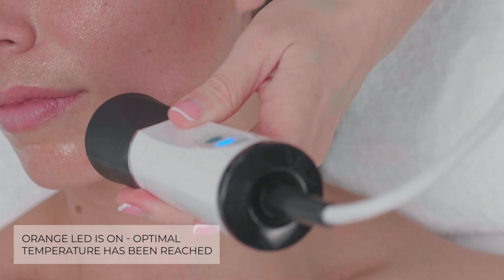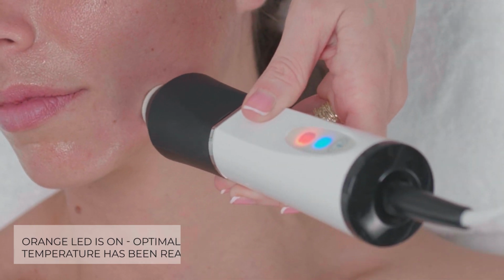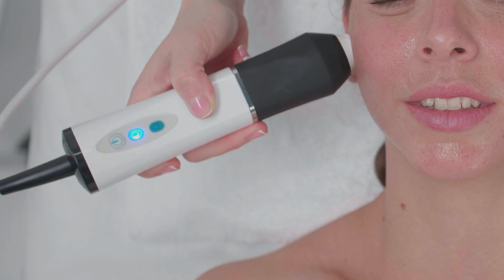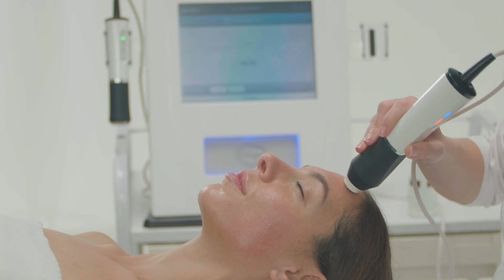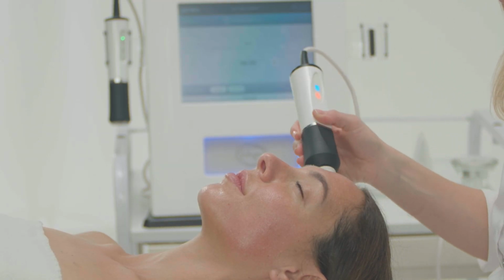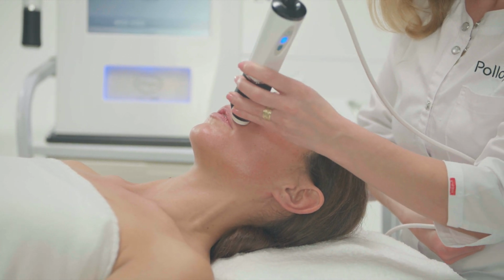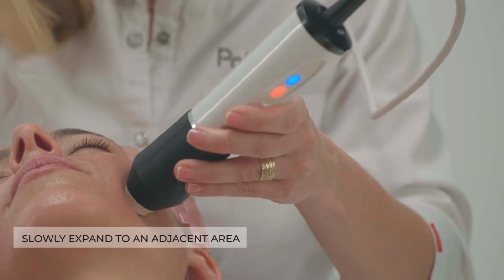When the skin has reached the optimal temperature, the orange light turns on. If you didn't reach the target temperature within 2 minutes, you may increase the RF power. When the orange light starts blinking, continue the slow circular movements over the same area for a few more seconds, and then slowly expand to an adjacent area.